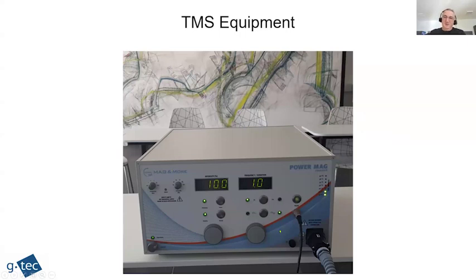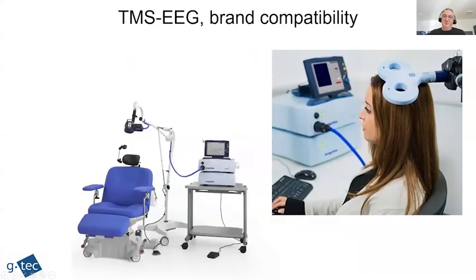In our case, we have a bit older model. There are also different brands, but essentially they all have a coil, a pedal to start the stimulation. We can adjust the intensity and the frequency of the stimulation, and they all have a trigger input and output.